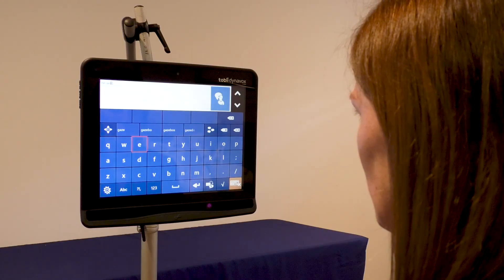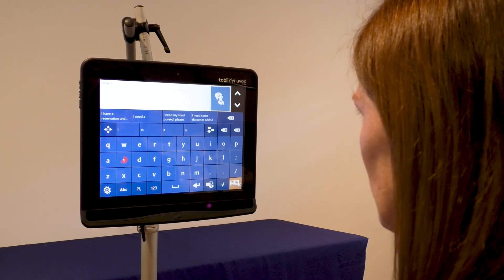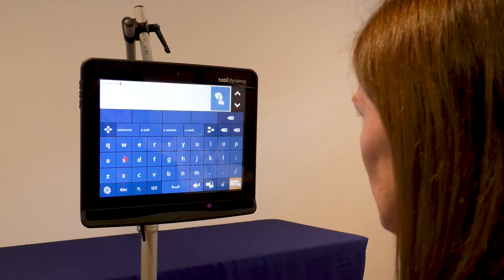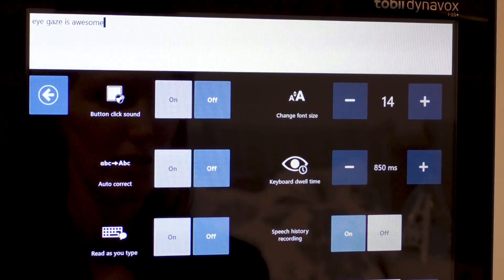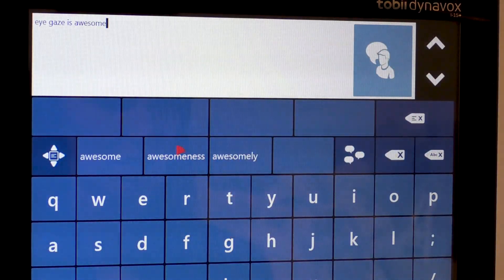The amount of time someone needs to look at an item to make a selection is called dwell time. This can be altered to suit the student, and some adjustment may be required in the initial stages to determine the most suitable timing. If the dwell is too fast, there is more risk the student will make selections they didn't intend to. If the dwell time is too long, it can be difficult for a student to maintain their gaze in the same spot for long enough to select.